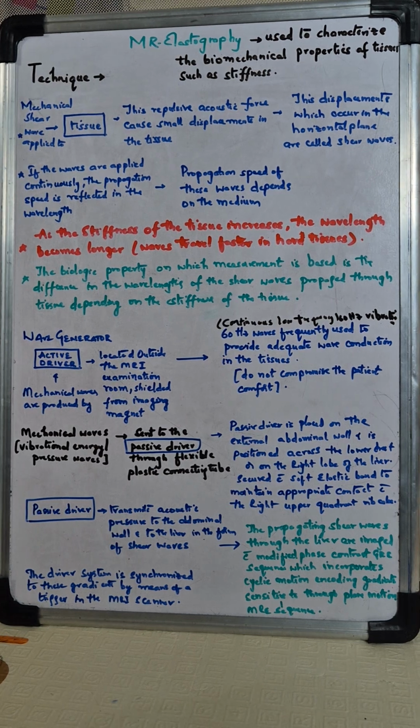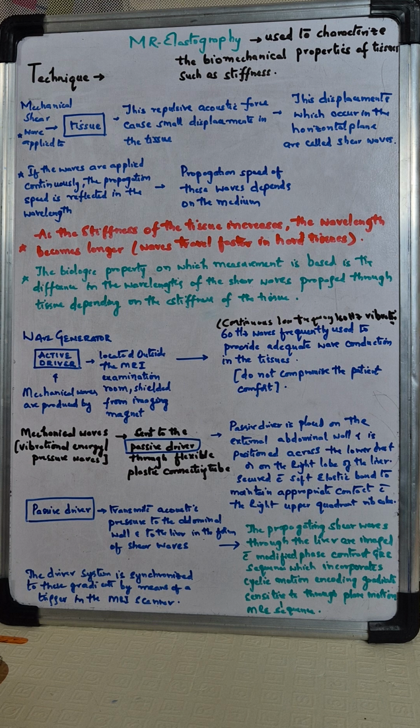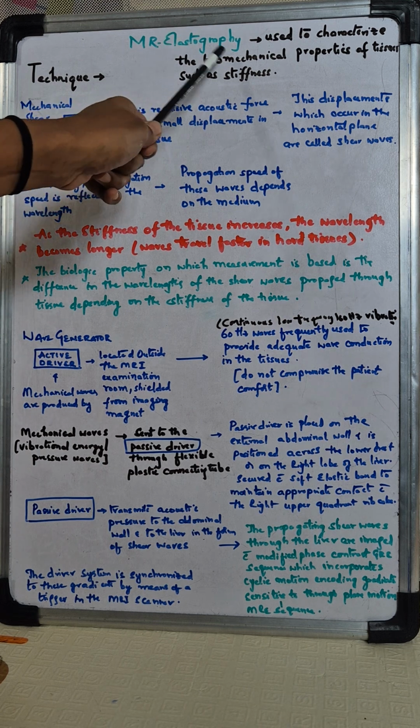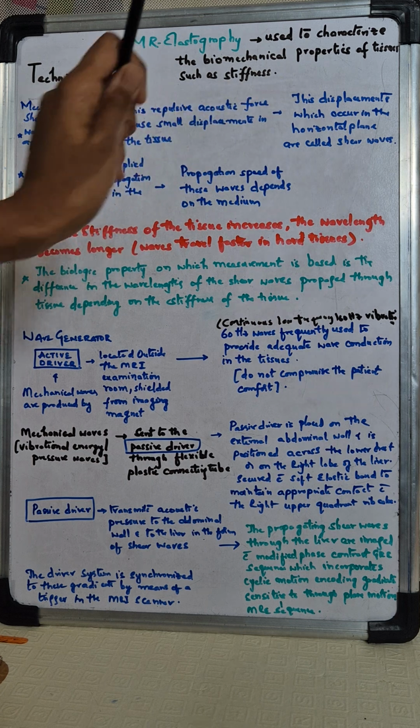Morning everybody. Today we'll be discussing the technique of MR elastography. In the previous video we discussed the principle, that MR elastography is used to characterize the biomechanical properties of the tissue, such as stiffness.